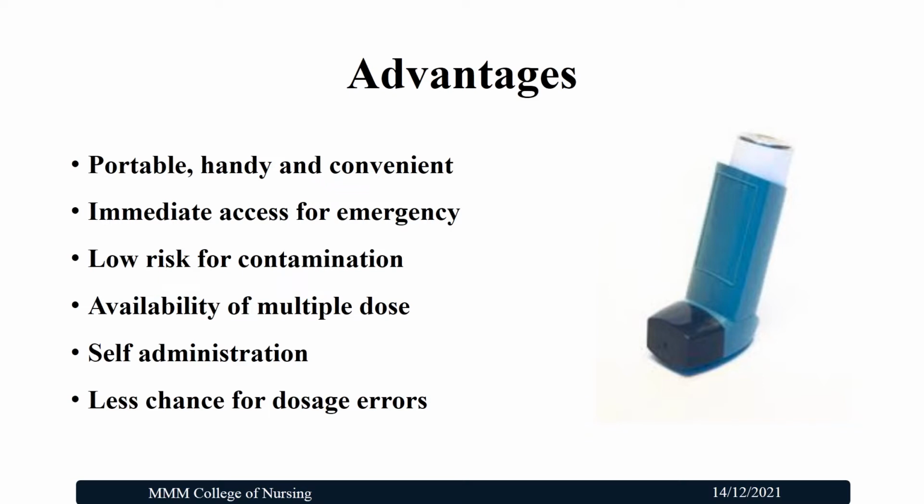It has low risk of contamination and it is available in multi-dose form, so there is no need to buy each and every time. And the very important advantage is that the patient can administer by themselves. They need no help from healthcare professionals, so it is easy, they can get the medicine at any time, and there is less chance of dosage errors.